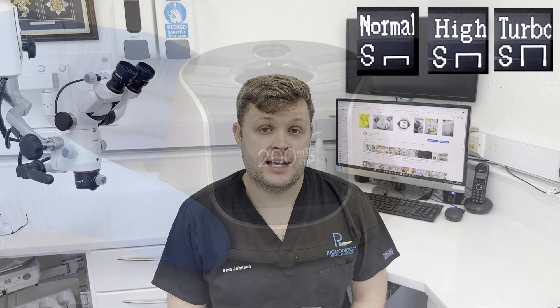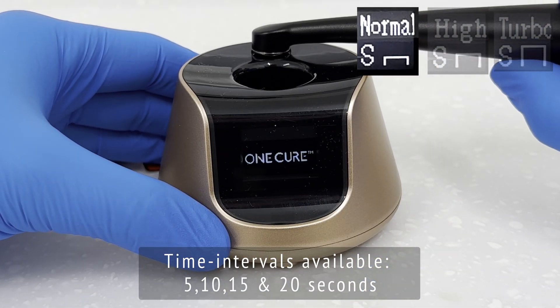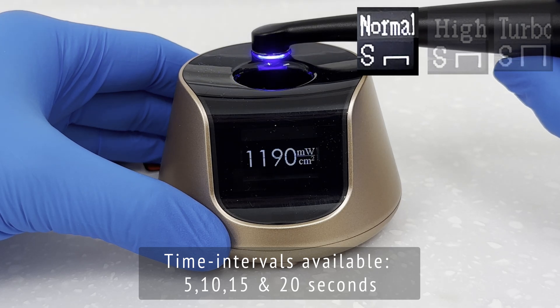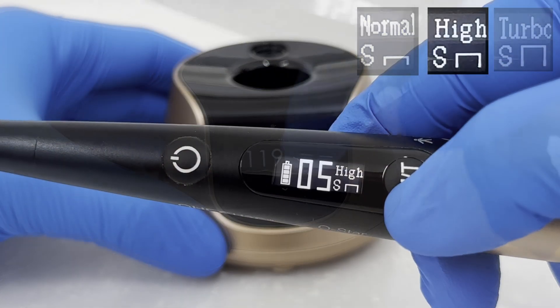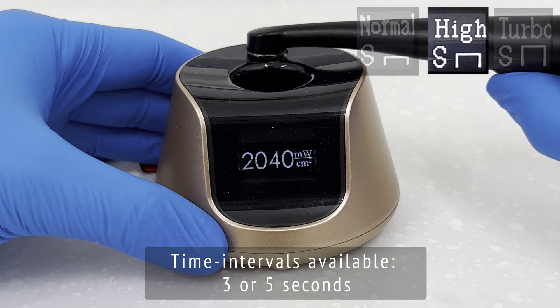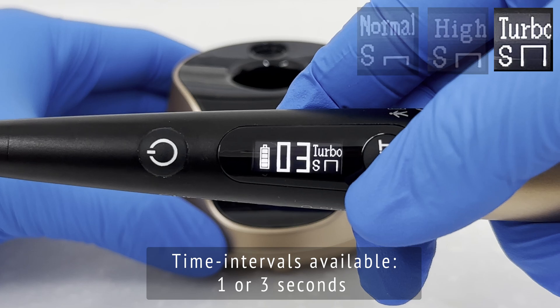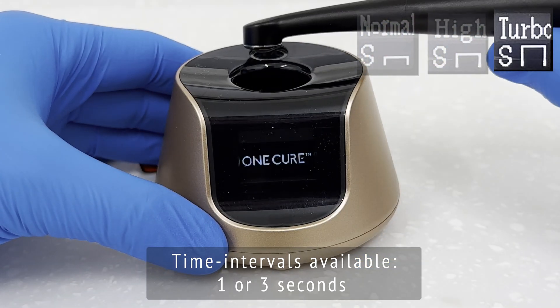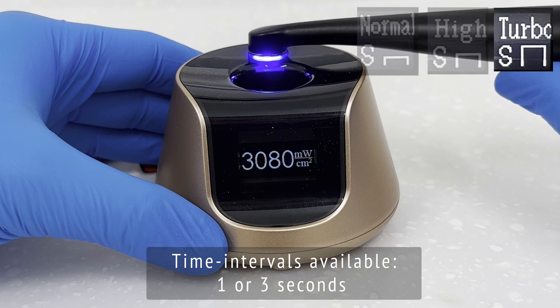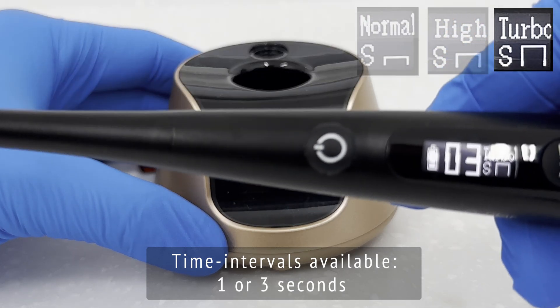The first group is what I call traditional curing settings, where the beam intensity remains constant throughout the given time frame. Normal mode allows curing times of 5, 10, 15, and 20 seconds, adjustable by holding the M/T button. The next mode is High, where the radiometer shows intensity almost doubles; available curing times are limited to three or five seconds. Finally, Turbo is nearly three times the intensity of normal mode, with curing times of one or three seconds.